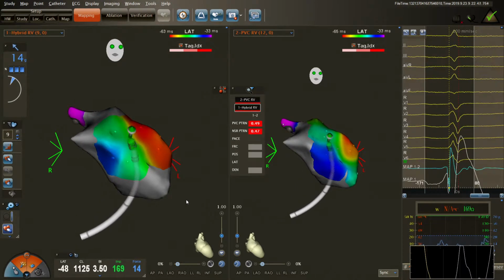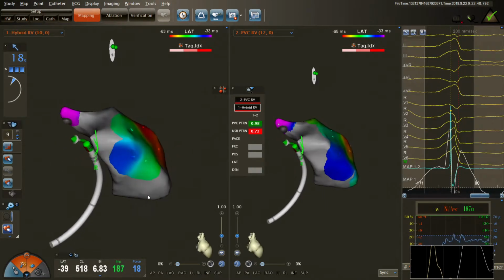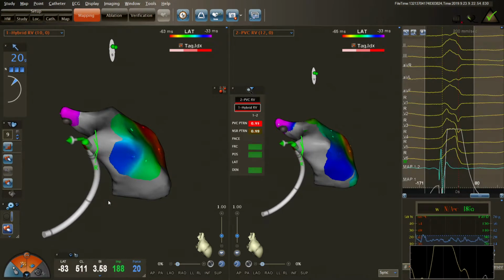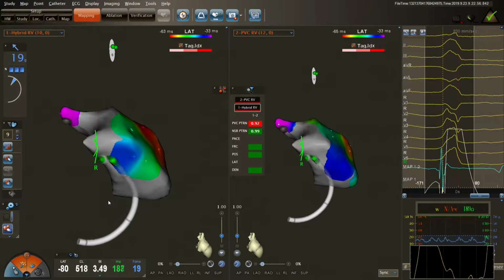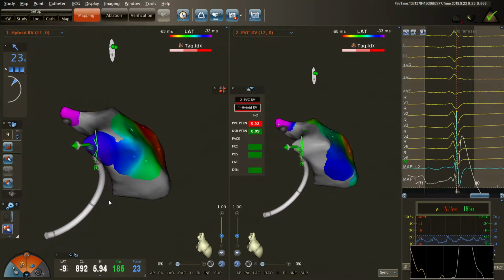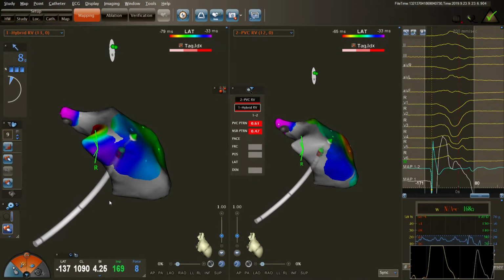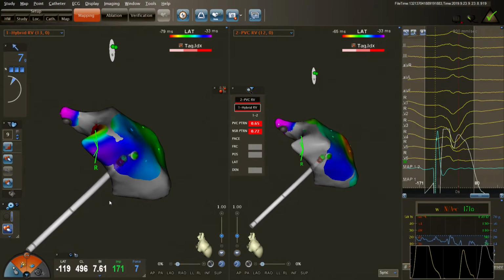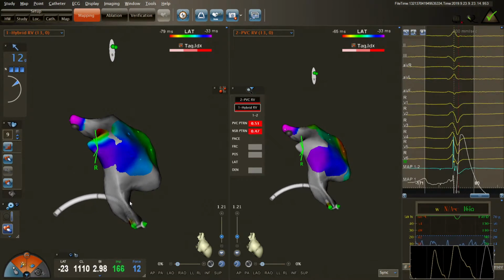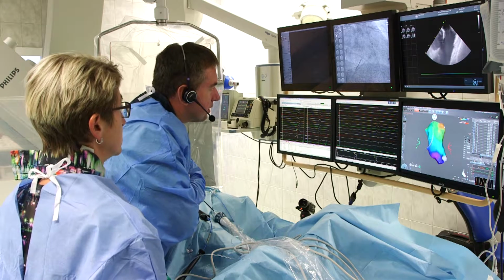It's quite obvious that the speed of creating the hybrid map is significantly slower compared to the legacy PVC activation map, simply due to the fact that we need two sinus beats followed by the extra beat matching predefined criteria. On the other hand, the conventional activation map needs only frequent PVCs matching the predefined criteria to be reconstructed. However, the hybrid map guarantees higher spatial accuracy since the 3D geometry is reconstructed from the normal sinus beats and activation is only superimposed on this 3D shell.